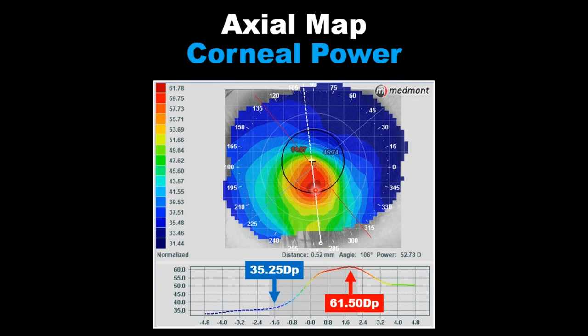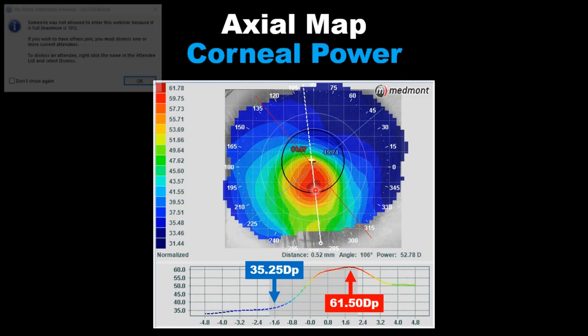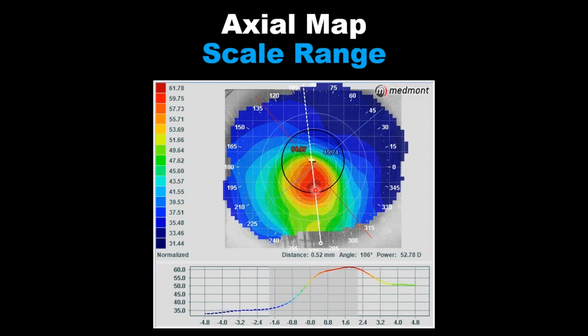La parte grisácea en la gráfica inferior vemos de 60 a 35 — es un mapa normalizado. El punto más curvo es 61.78, el más plano 31.44. Fíjense en la pupila: miren todos los poderes que caen dentro de ella. Dentro de esa pupila tenemos 61.50 como punto más curvo y 35.25 como punto más plano en términos de poder — una diferencia de 26 dioptrias entrando la luz por esa pupila.